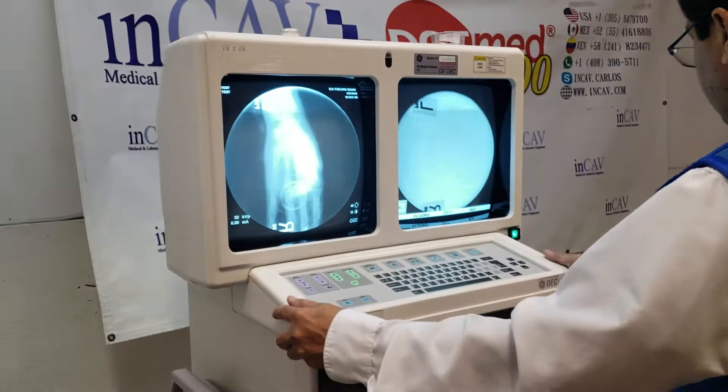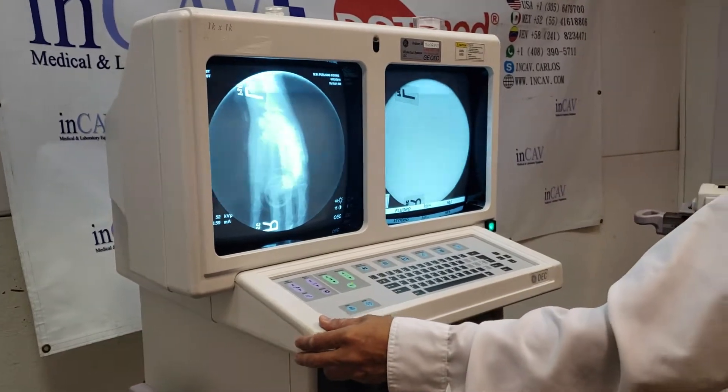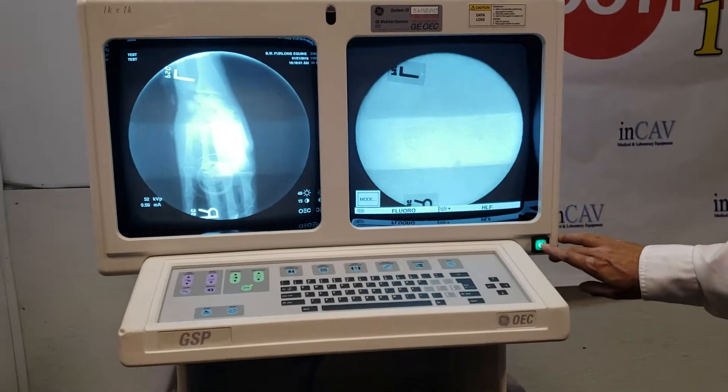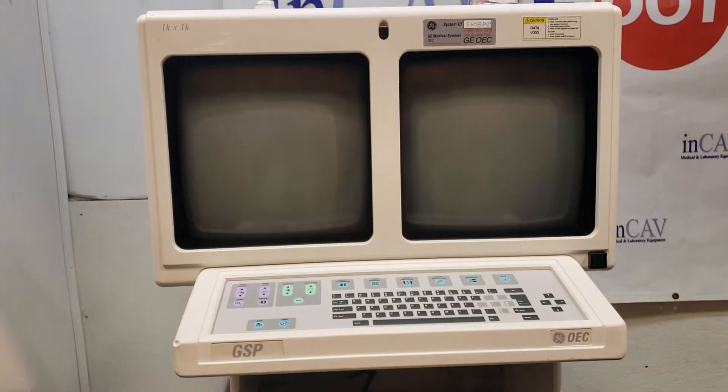Finally, we are going to see how to shut down the system, the 8800 or the 9800. Basically, push the button. When you finish and you save everything, just push the button. And that's it.